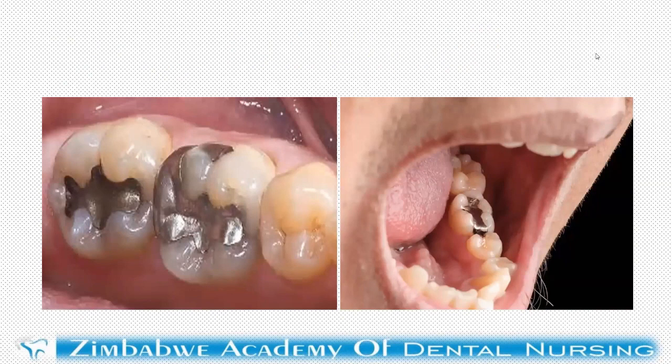There's an example. What you can see on the screen there is an example of a dental amalgam filling on chewing teeth.